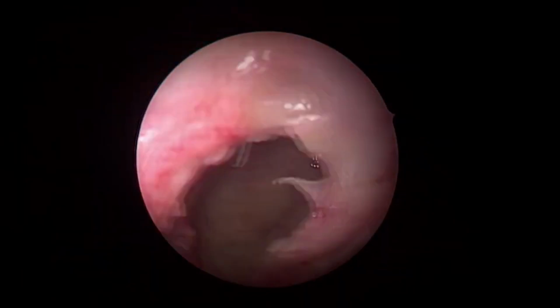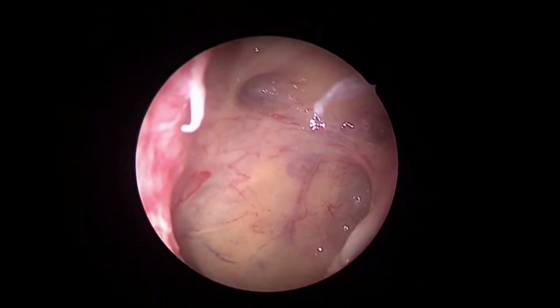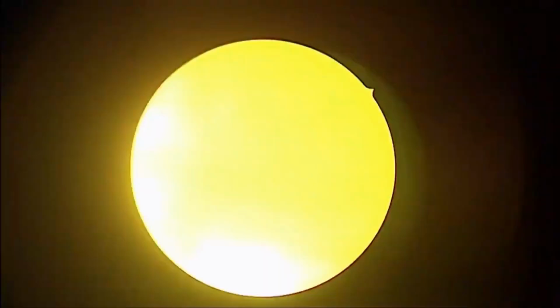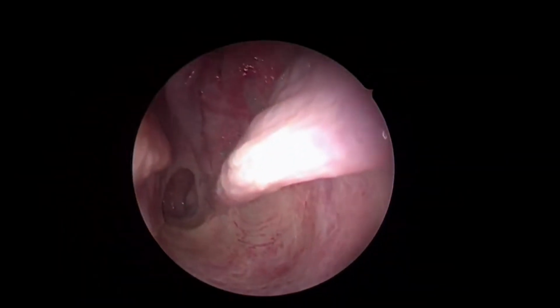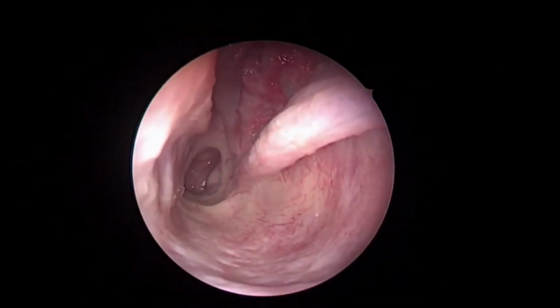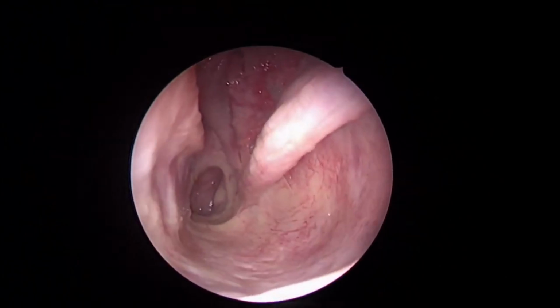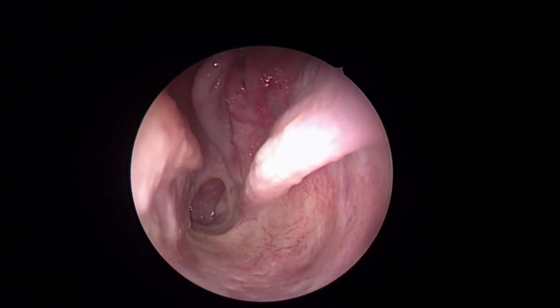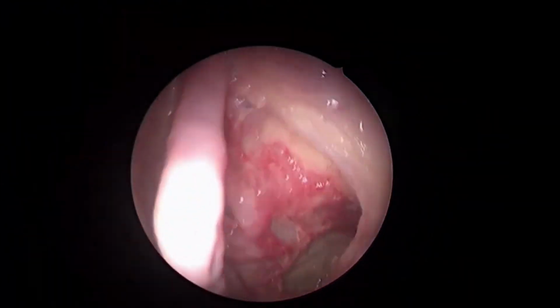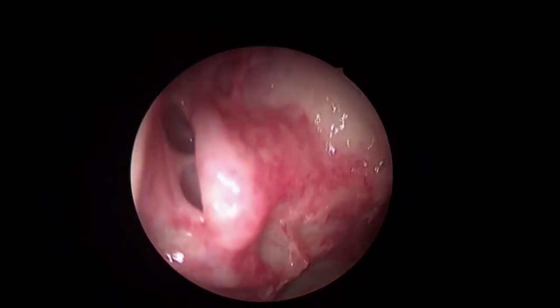See that? That is the interior, and if I rotate further, you can see even the anterior wall. You can see now. So this is the interior of the maxillary sinus, and this is 70 degree. I told you this is so versatile, I can make it 0 degree. Which degree telescope is this now? 70. Looks like 0 degree. The reason is I made it more vertical, and I can work it like 0 degree. Now when I make it horizontal, I can work it like any degree I want to. This is 70 degree now.